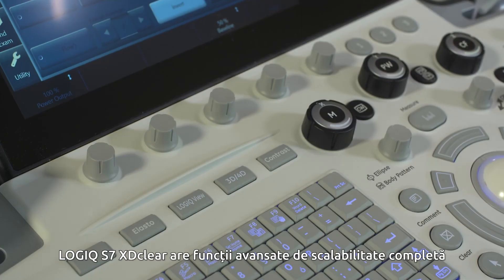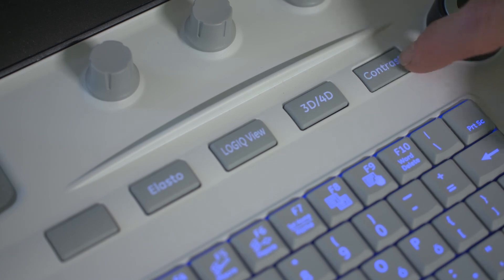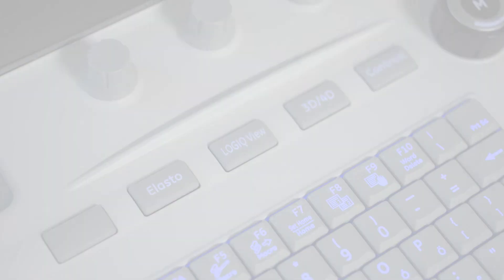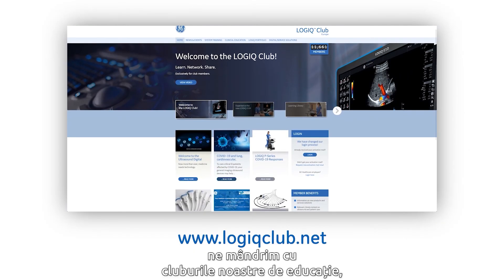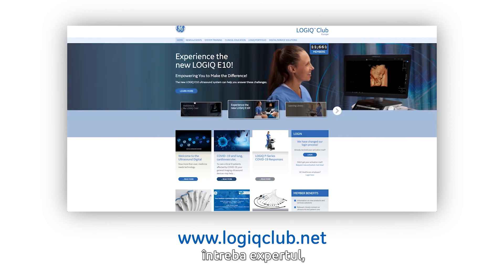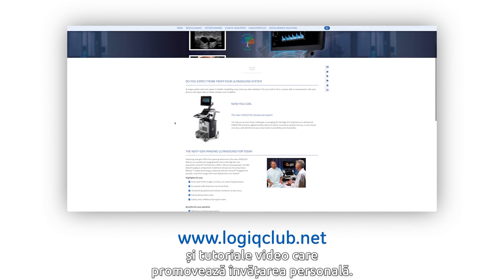The Logic S7 XD Clear has full scalability of advanced features to meet your needs, including contrast, shear wave, strain elastography and B-Steer+. And finally, we pride ourselves on our education through our loyalty clubs, where you can access webinars, ask the expert, white papers and video tutorials to promote self-learning.